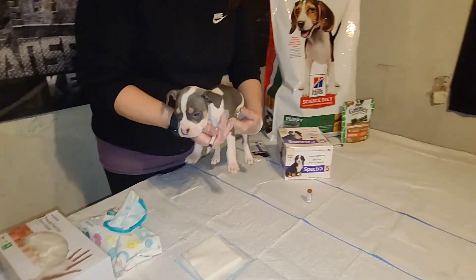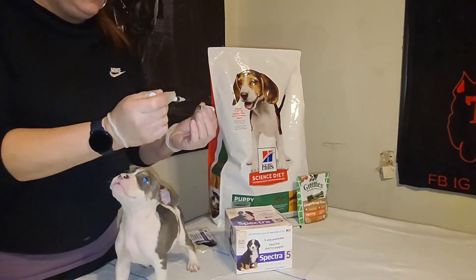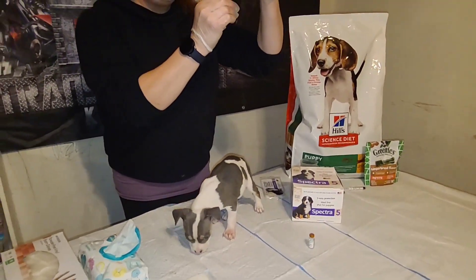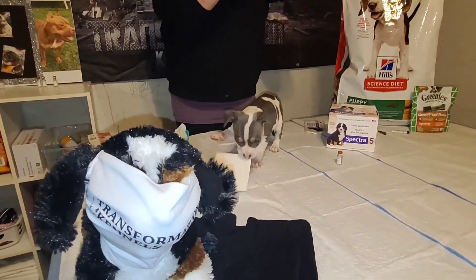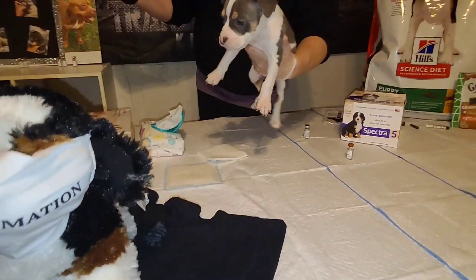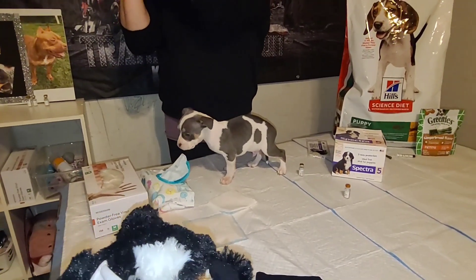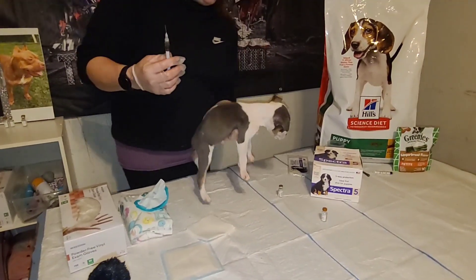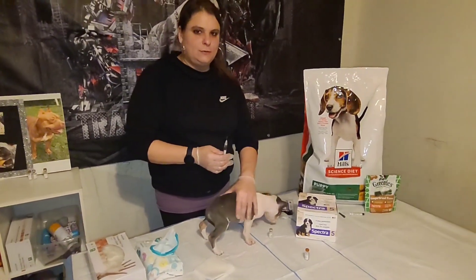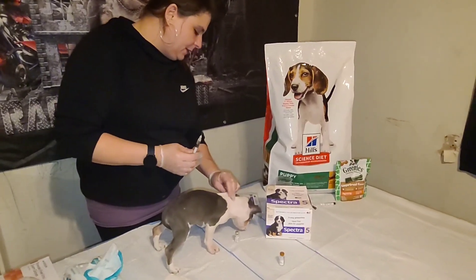We are doing the vaccines on American Bully pups, but you can do the same steps for any puppy pretty much. We're going to get the air out of it. Going in sub-Q — we're not going into the muscle on the puppies. You can pick different spots, but right here is where we're going to go in.